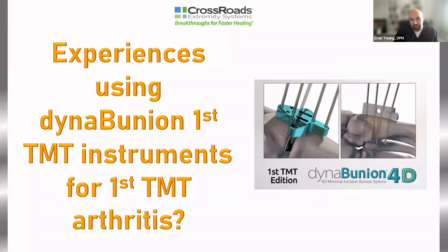But that's really splitting hairs. In my opinion, I think for the most part, I love how this works. And like Dr. Campbell said, if you don't have to worry about transverse plane deformity along with frontal plane, and you're just putting this thing back together, it's just 2 cuts and put the rack block on, so it makes it super quick.